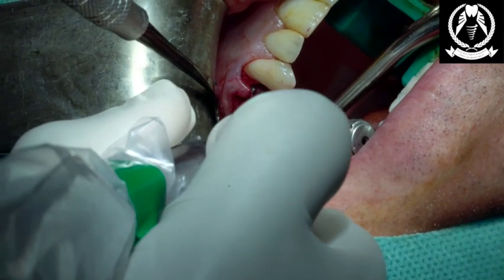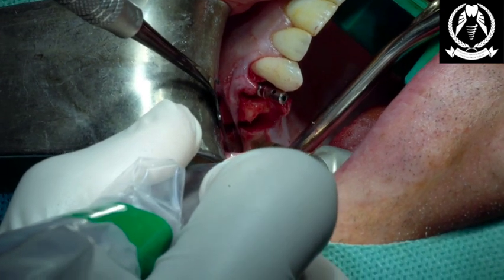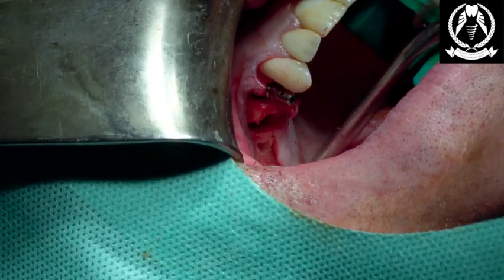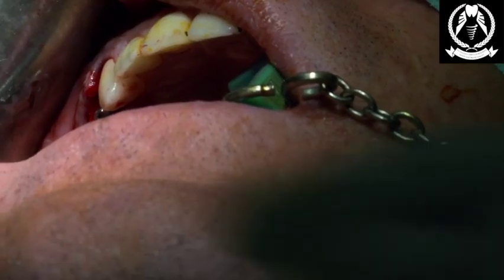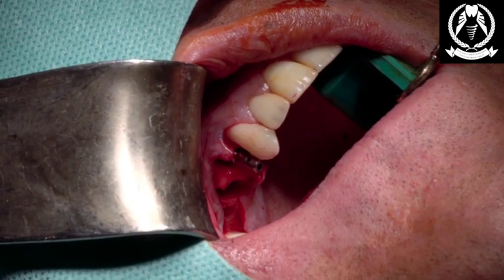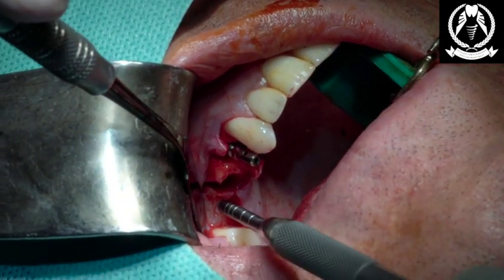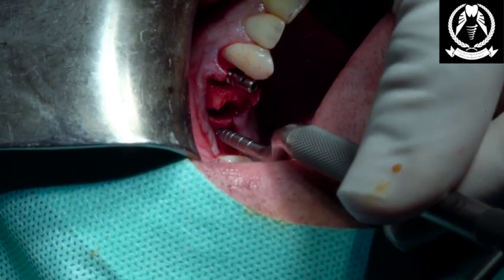A little bit wider. So again, we've got drill access issues, so I'm going to come in sideways and then correct. Down to there. Perfect. So now we are sitting at the sinus floor, and we're going to do the rest of it with the osteotome. And we're going to punch up through into the sinus. Okay, Alan, a little bit of tapping, buddy. Might feel weird.